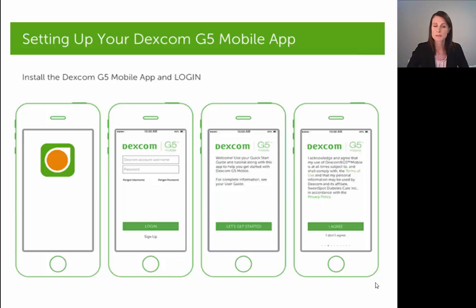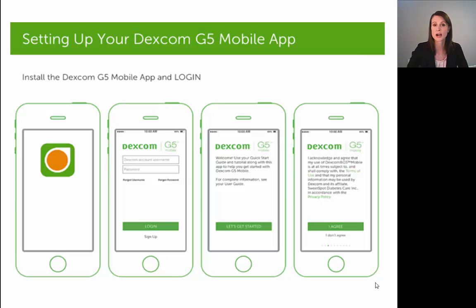When you download this app from the app store, install it on your smart device, and open it for the very first time, it's going to ask you to log in with a username and password. If you've created a username and password with Dexcom in the past, make sure you use that same username and password to log in. But if you've never created an account with Dexcom before, there is a signup option where you can create an account and username and password to log in.